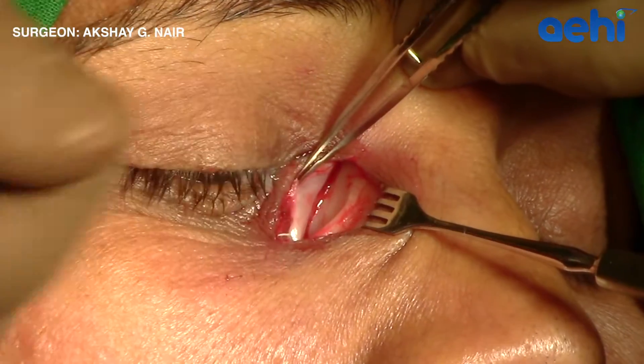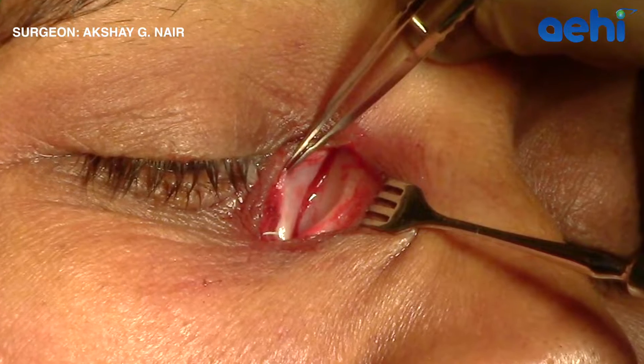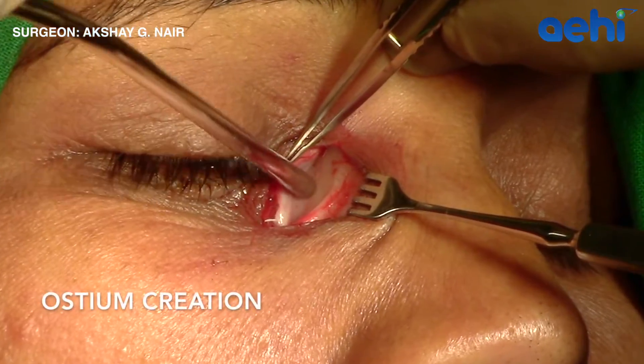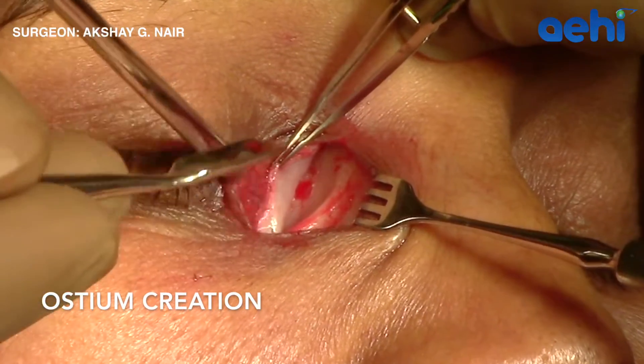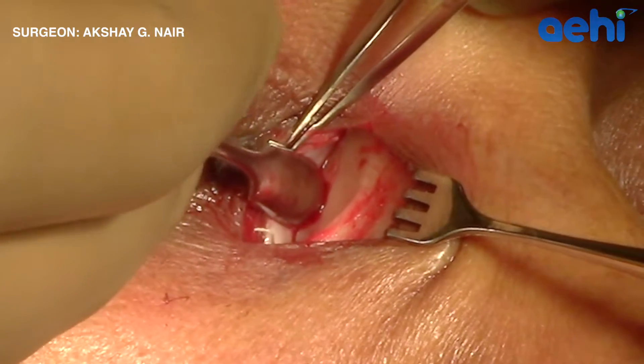Here, a suture line is visible. This is the junction of the frontal process of the maxilla anteriorly and the lacrimal bone posteriorly. An instrument like the periosteum elevator can be used to create the initial opening at this site.